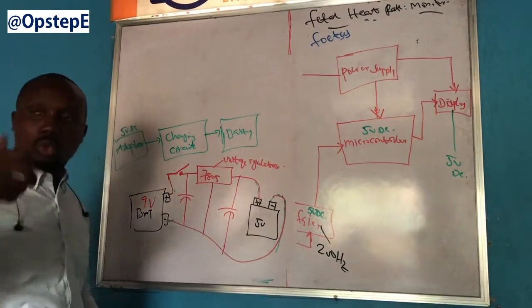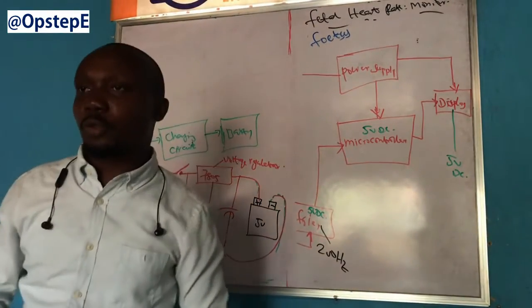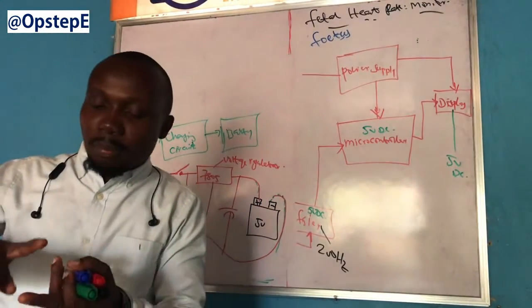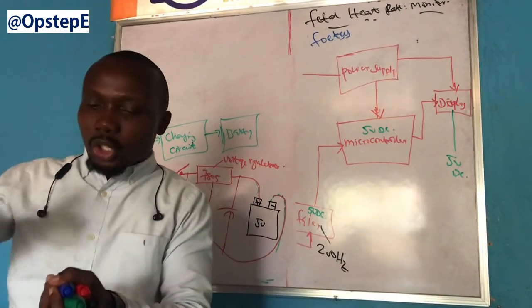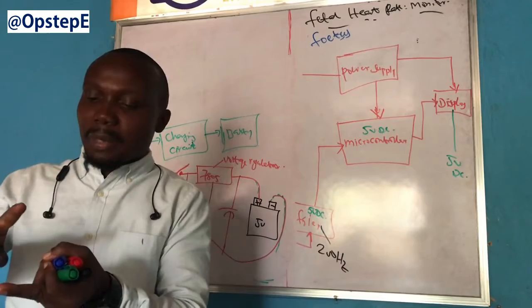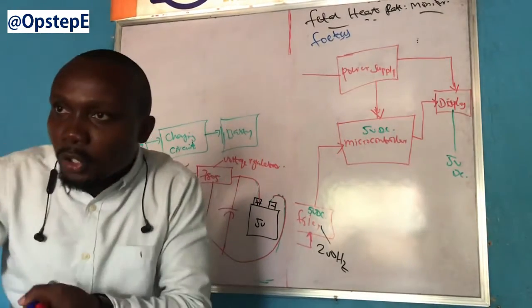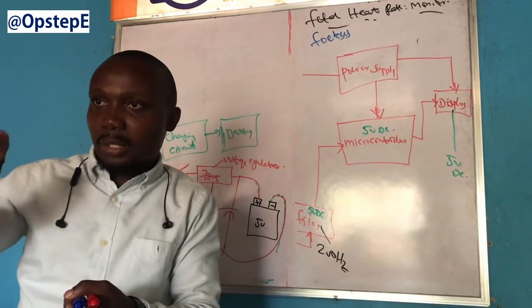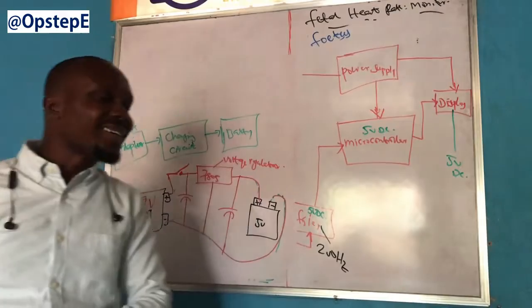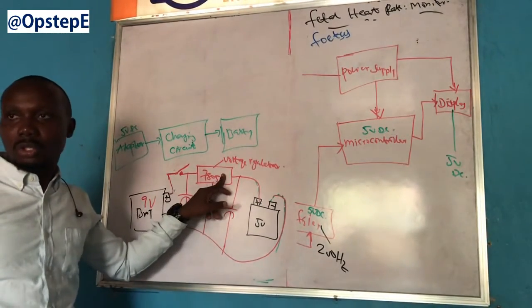Most times when you flip a switch, it doesn't close immediately, because mechanical contacts don't connect right away. Sometimes it bounces before it closes. And that bounce can create electrical spike, a very little electrical spike that, if not taken care of, over time will damage this voltage regulator.